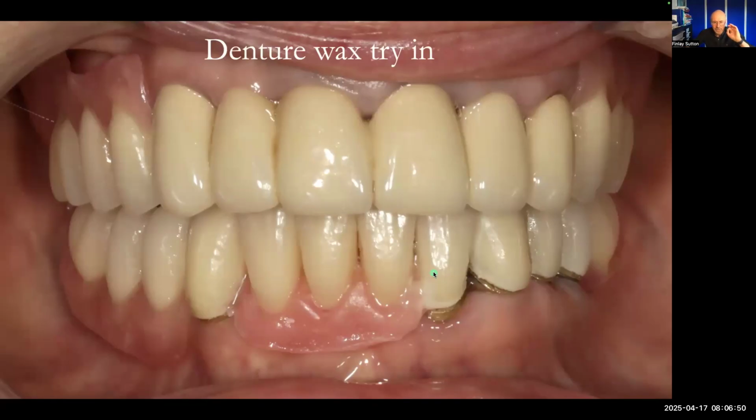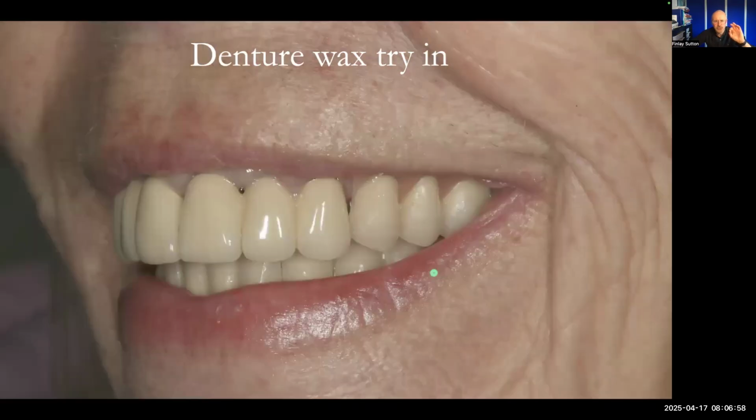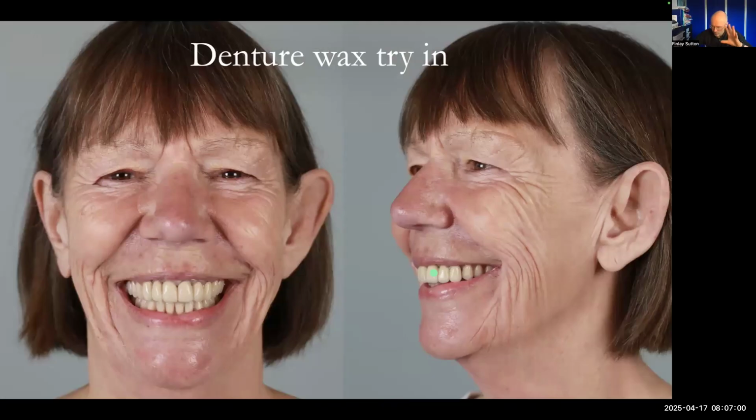So this is the wax try-in, making sure everything looks good, doing my photos, also having a good look and letting Jackie have a really good look at herself, having a look in the video, making sure she's totally super cool about this. Because I have increased the vertical for her there, you can see. And so, the lowers are going to be showing a little bit more just to give us a bit more room there too.